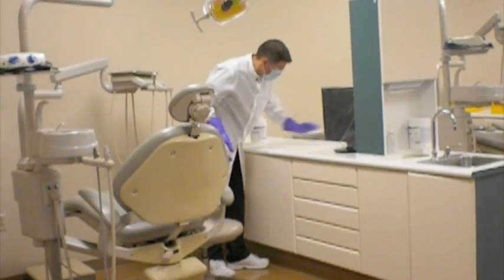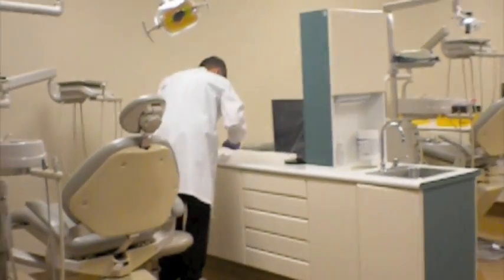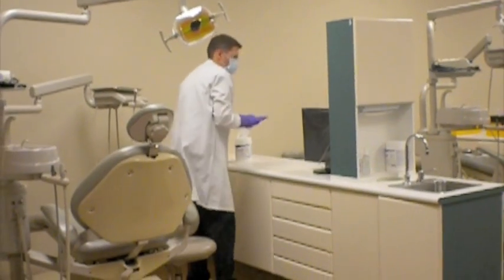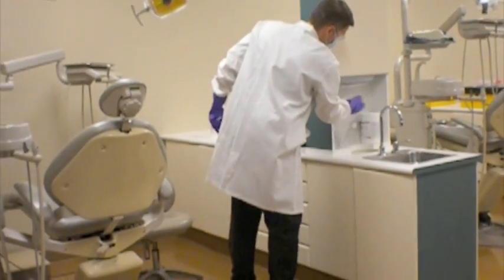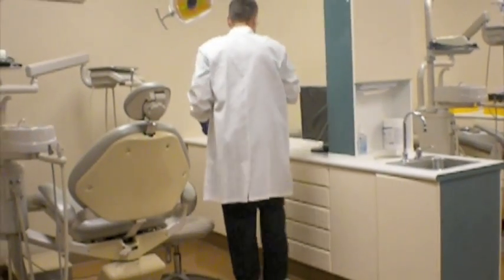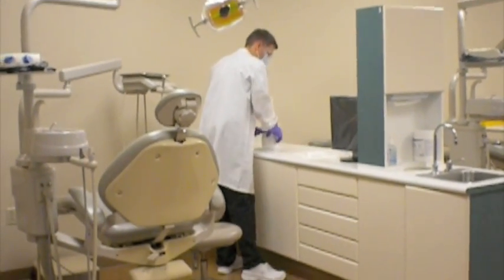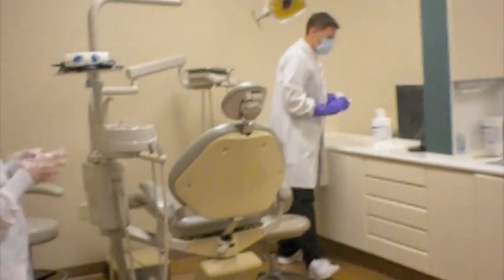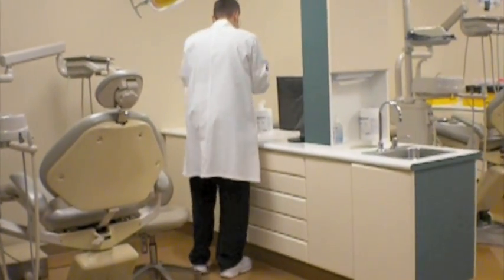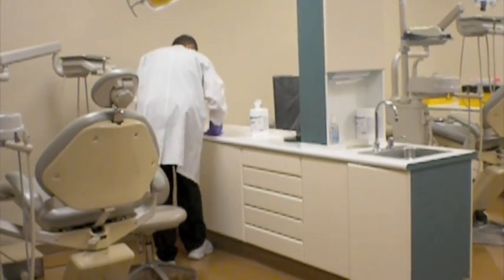And he's going to place a new paper towel on the countertop, move the canister over, and discard the contaminated paper towel that was sitting on a counter that has not been sanitized. So new paper towel, move the canister, throw out the old paper towel, and he's going to continue wiping the sanitization wipe of the countertop.